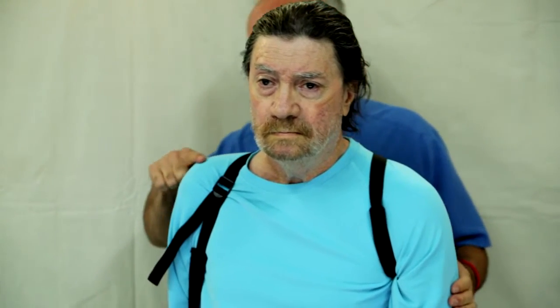There we go. Now if you compare the two shoulders, you can see that we're rounded here and we're rounded here. So that's the reduction of the subluxation — that's the proper adjustment of the Give More Sling to reduce the subluxation. Thank you.